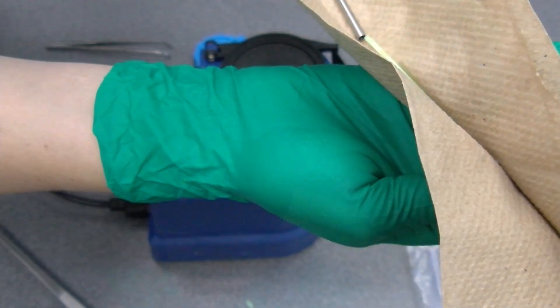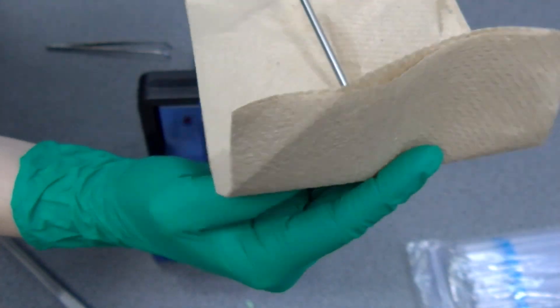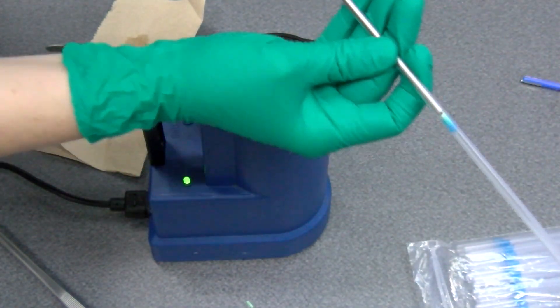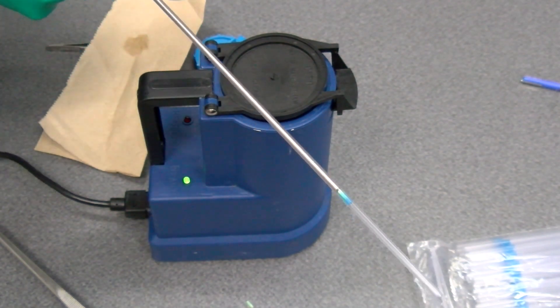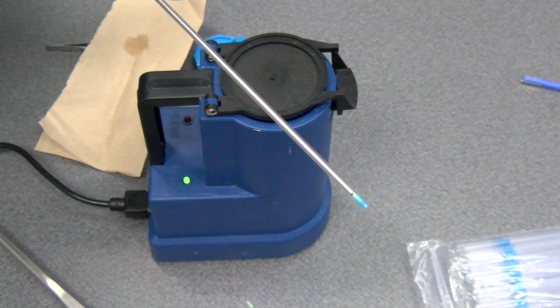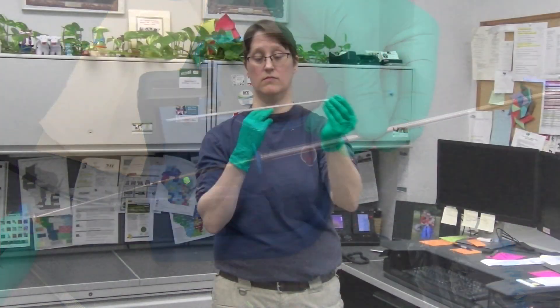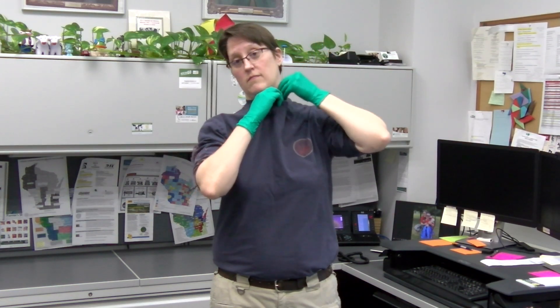Using scissors or a straw cutter, cut a quarter inch below the sealed end of the straw at a 90 degree angle. Insert the cotton plug end of the straw into the AI gun and slide the plastic sheath over the gun. Most sheaths are designed with a tip that will lock into place to prevent backflow. It is important to ensure the sheath is secured on the flange of the AI gun.